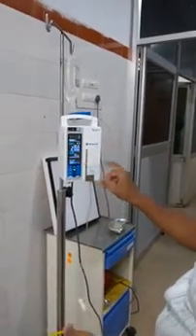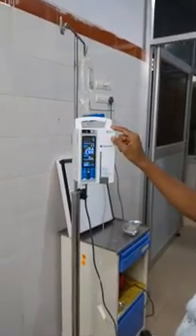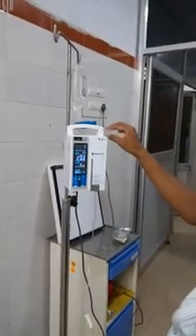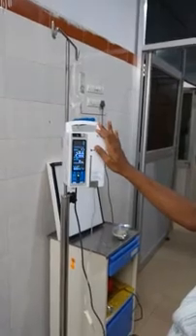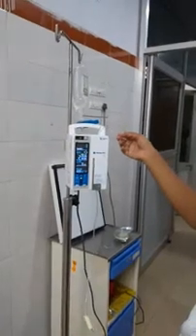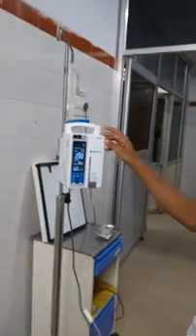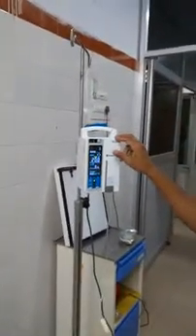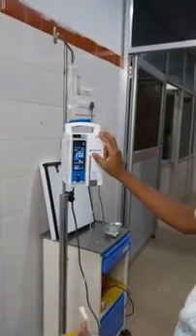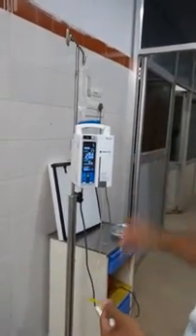Fine. Now, a very important thing I was speaking about is that this segment which passes through it has to be changed after every 12 hours or 24 hours, so that the flow accuracy will be maintained. And after 72 hours, at least this tubing has to be changed, otherwise the flow accuracy will drastically drop, and the amount of fluid we are delivering might not be right. The flow accuracy is between plus or minus 5% to 10%, and that will vary if this becomes old and used. Thanks.